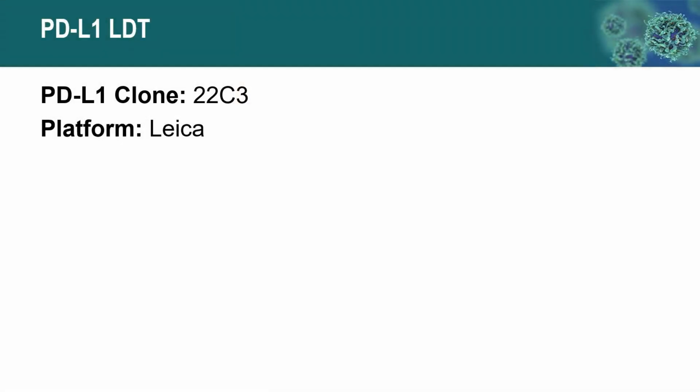Dr. Chibukula, how about at your institution? So we use PD-L1 testing in-house. We do it in our laboratory. We use the Leica Bond Max, and we use the 22C3 antibody, which is labeled as LDT, and it's called the LDT kit. That's the antibody kit that we use.